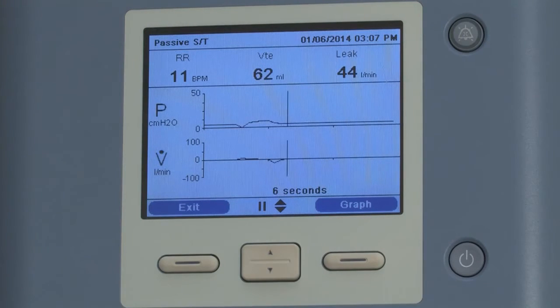In addition, they've added to the sensitivity options or triggering options, meaning that when the child tries to initiate a breath and you see that little black or gray ball in the upper left-hand corner, there is now a sensitivity feature called AutoTrack-sensitive instead of just AutoTrack. So the options for sensitivity are flow trigger 1 through 5, 1 being the easiest, AutoTrack, and AutoTrack sensitive.